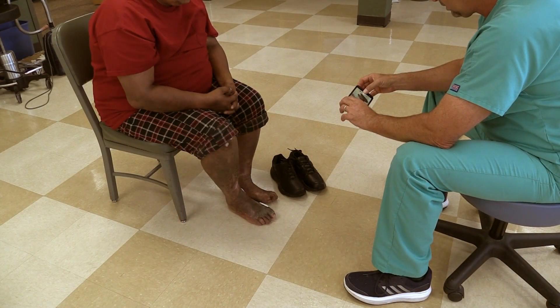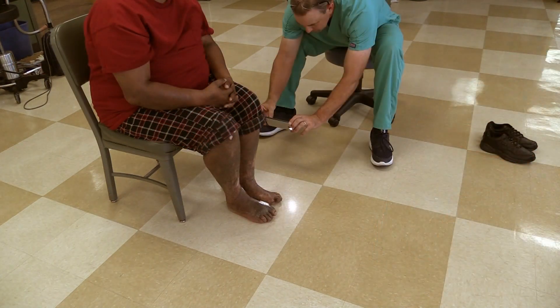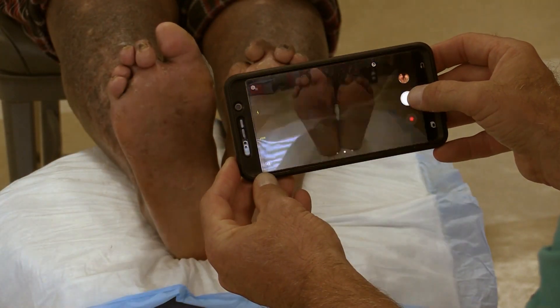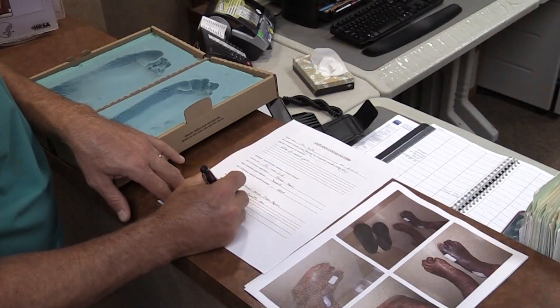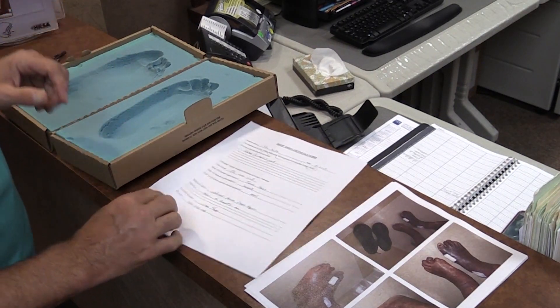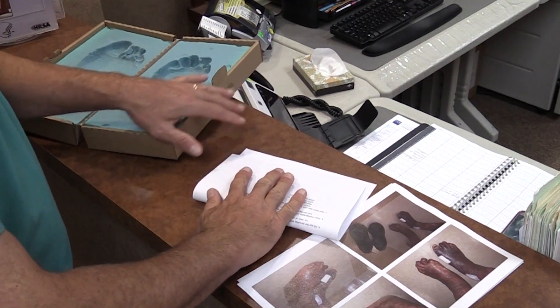Take pictures of the patient's feet and their footwear. Make sure to capture both sides and the bottom of the feet. Fill out the form provided and place the form and the pictures inside the box and ship to National Hansen's Disease Programs.